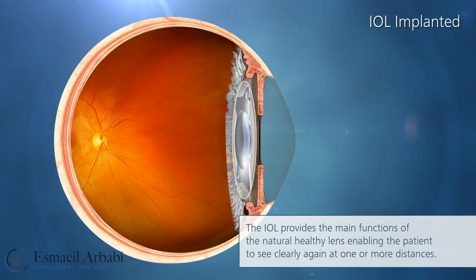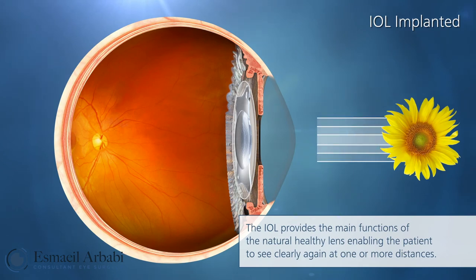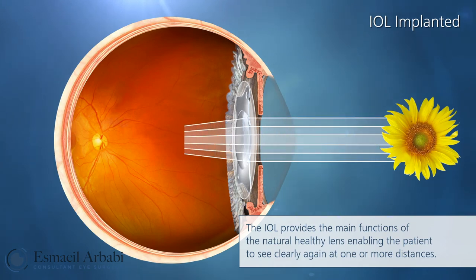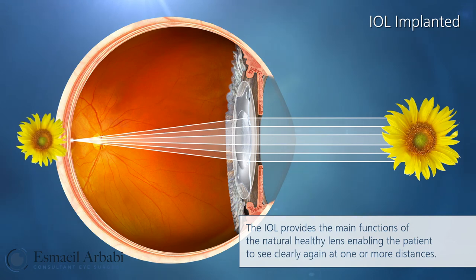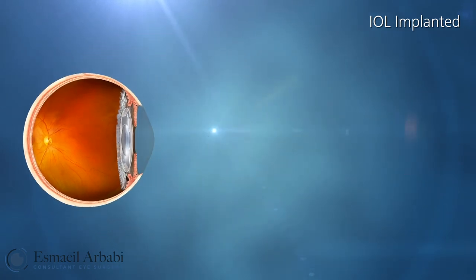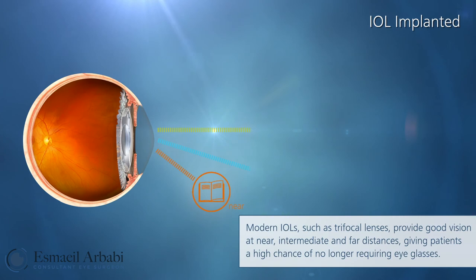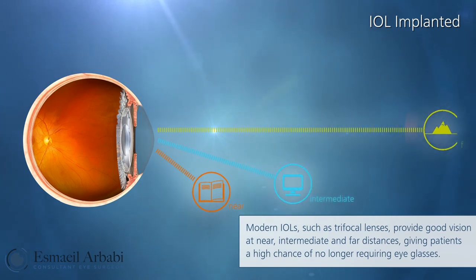The IOL provides the main functions of the natural healthy lens, enabling the patient to see clearly again at one or more distances. Modern IOLs such as trifocal lenses provide good vision at near, intermediate, and far distances, giving patients a high chance of no longer requiring eyeglasses.